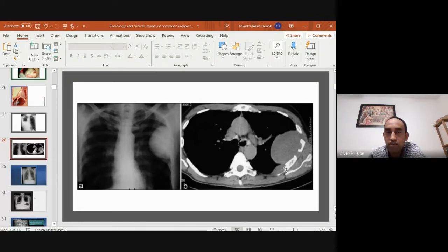It's arising from the pleural cavity, as you see, and there is some destruction of the rib, right? You see the rib being distracted? So this is a CT scan. That's one of the advantages of having a CT. A normal rib appears like this. So part of the rib is degraded, invaded, eroded. So this is a pleural-based mass, and you see it's completely localized somewhere.